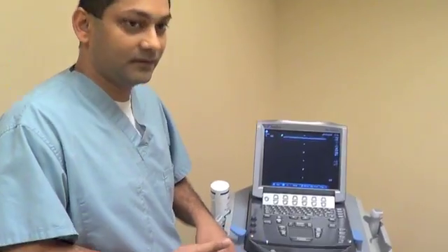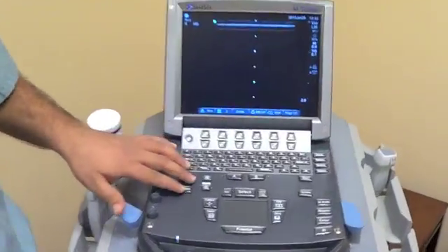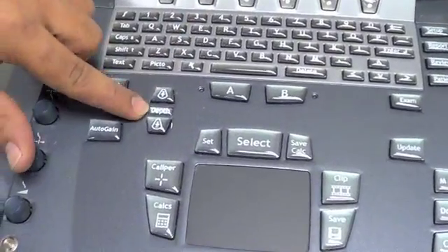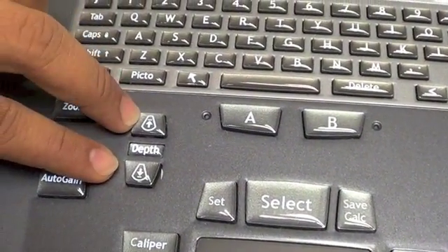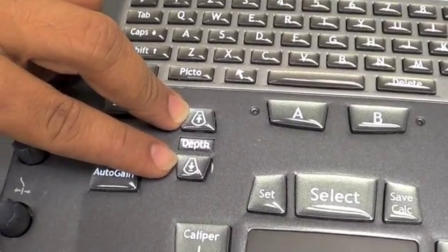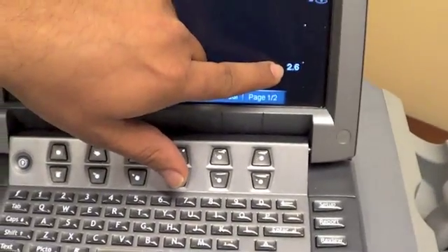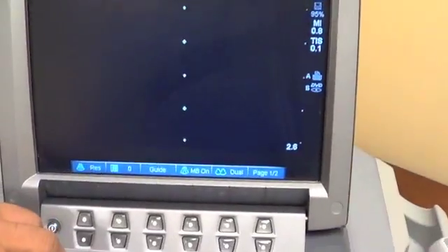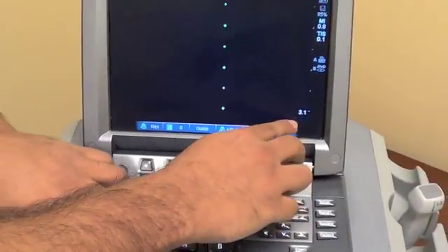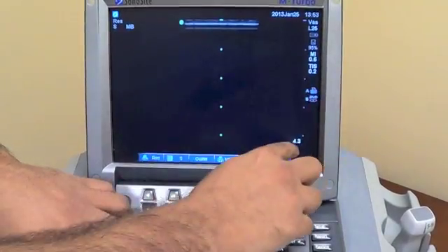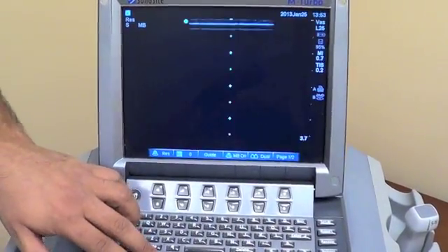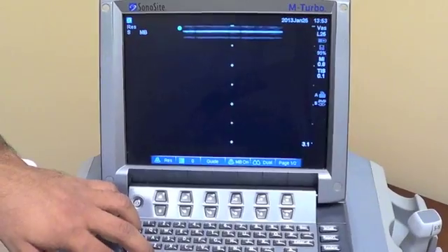What I want to talk about before we do any of that is the actual machine and what typical things we see. In most machines, the basic button you'll need to know is depth. Most machines have an up or down depth button, which controls how large the image is. If you look here, you'll see this one says 2.6 — that means 2.6 centimeters — and if we increase the depth, you'll see it goes to 3.1, 3.7, 4.3, with markers halfway between. That's an important button for most views you're going to try to obtain.